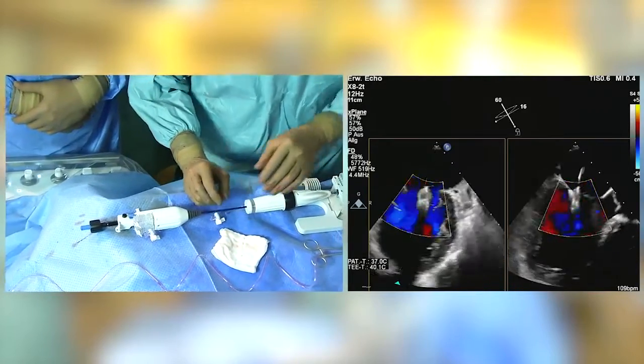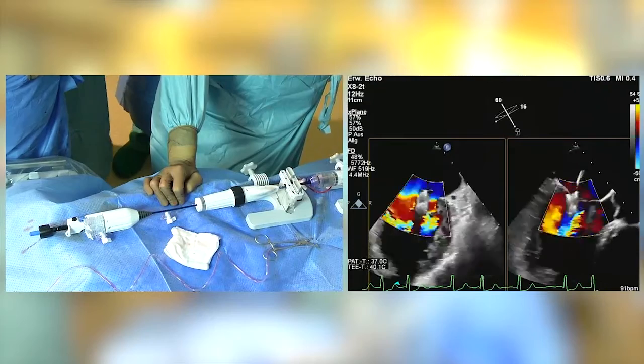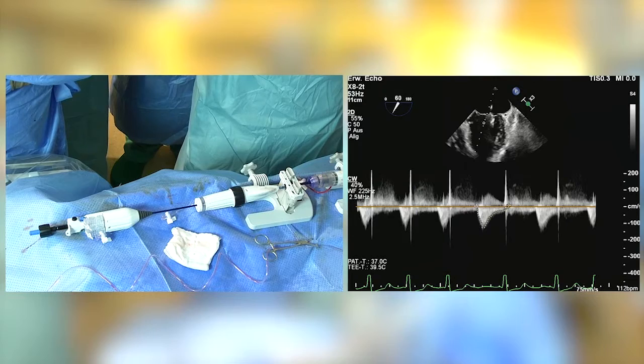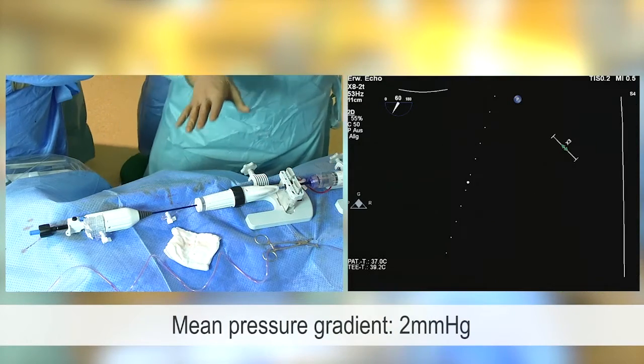And finally, after the third grasping attempt, we managed to achieve an acceptable reduction of the lateral MR jet. We still have mitral regurgitation medially, so next step, looking at the gradient. The gradient is 2 millimeters of mercury.